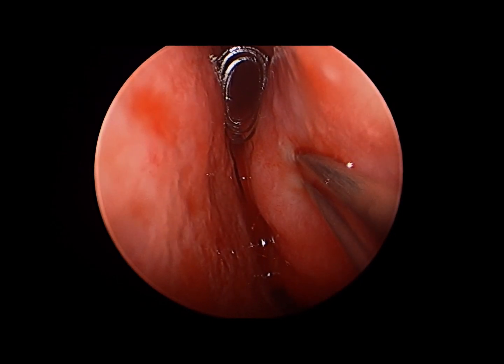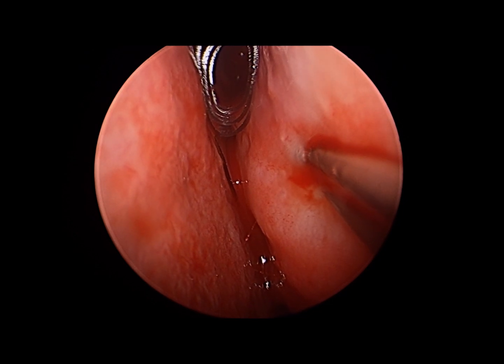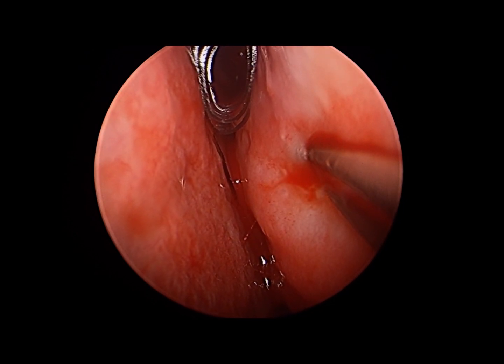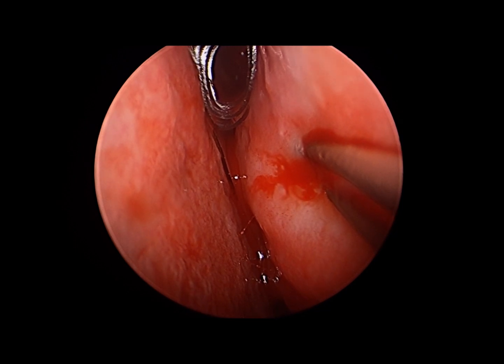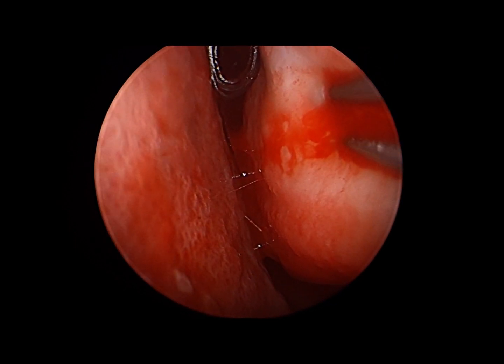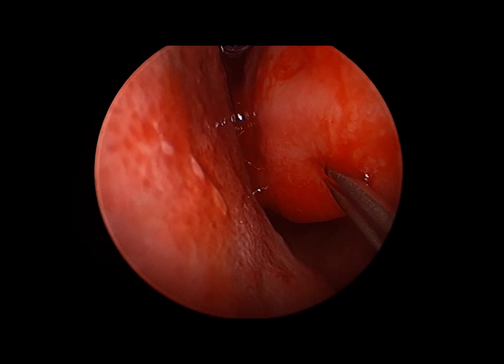You can see a gel film roll — that curled piece at the superior aspect of the screen — that is tucked into the patient's middle meatus, as the patient has had endoscopic sinus surgery. We've completed that portion of their surgery and now we are working on reducing their enlarged turbinates.